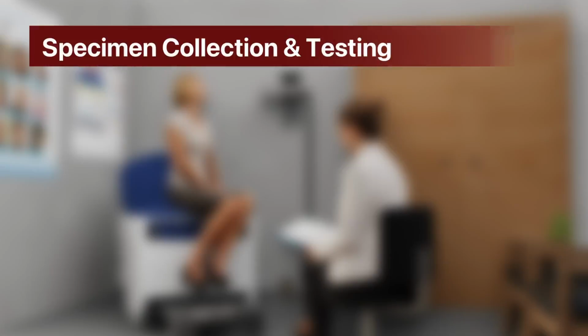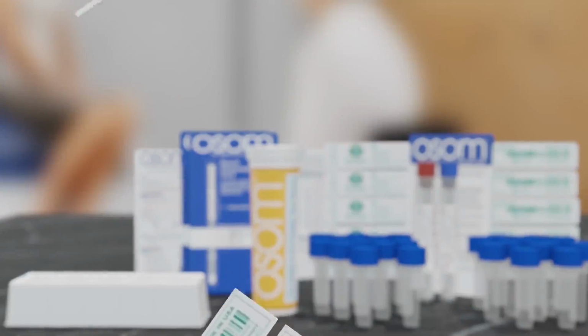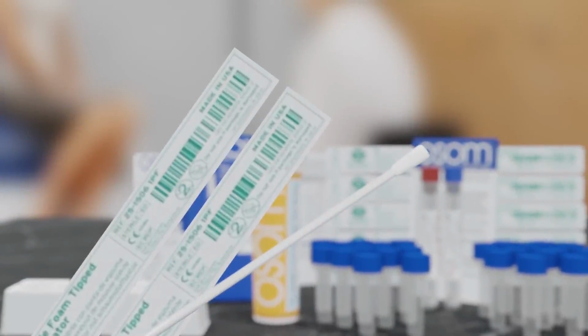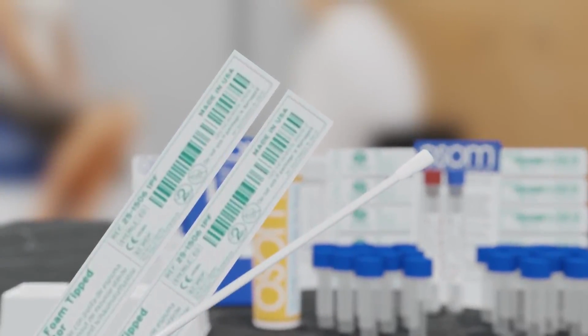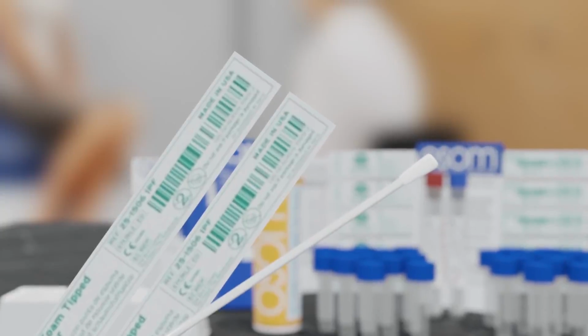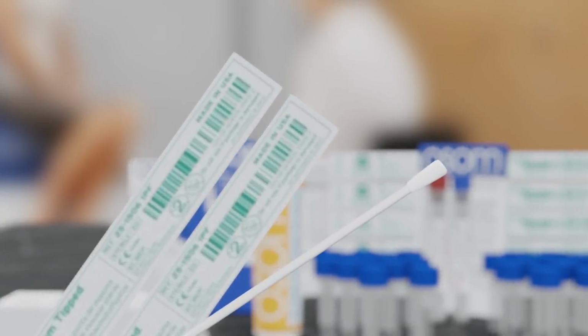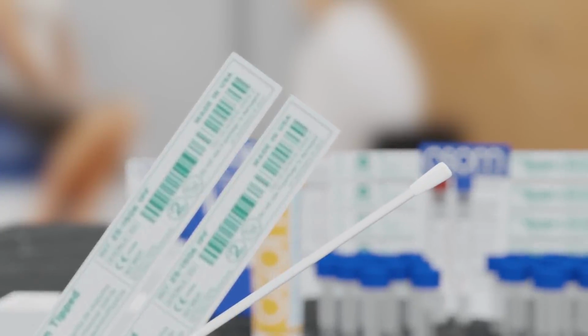Specimen collection and testing. Only nasal swabs can be used with this test. Use of nasal washes, nasal aspirates, or nasopharyngeal swabs has not been validated. Only use the nasal swabs provided in the kit. Do not touch the swab tip prior to testing.